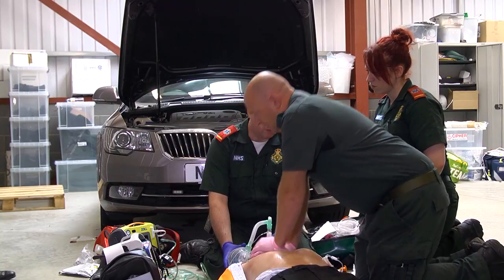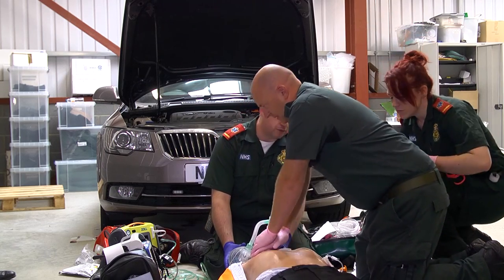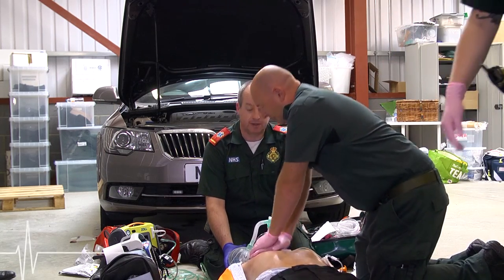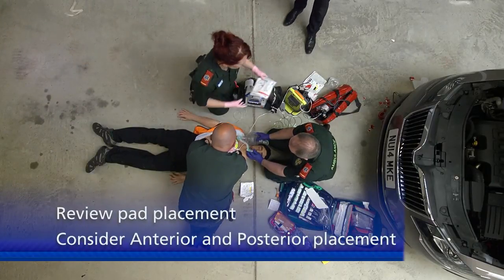Yeah. So should we consider changing the pad position? Mm-hmm. See if we can get them out of here. Potentially, let's go anterior-posterior with the pads. So yeah, we need a new set of pads, Sean, if you could. And let's get those applied.